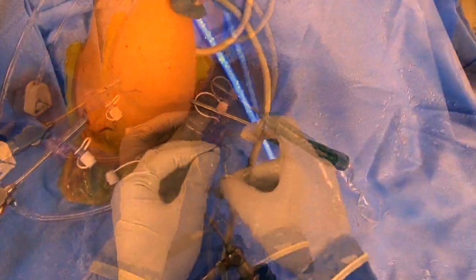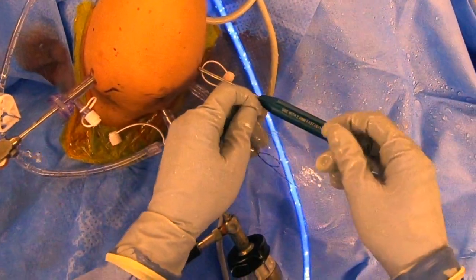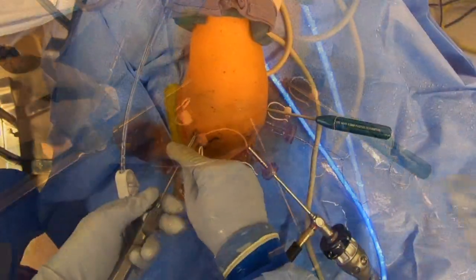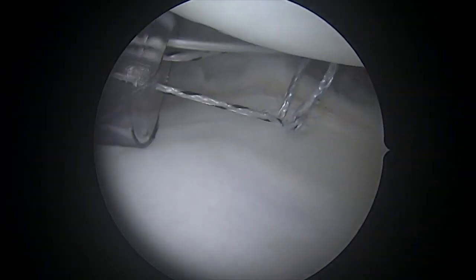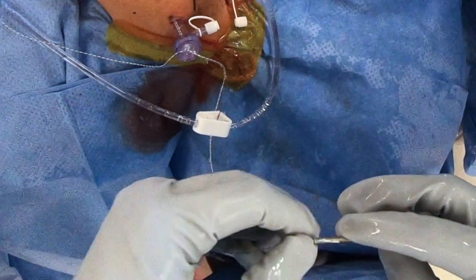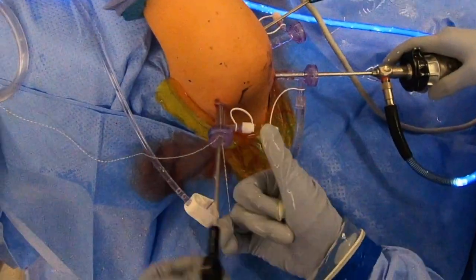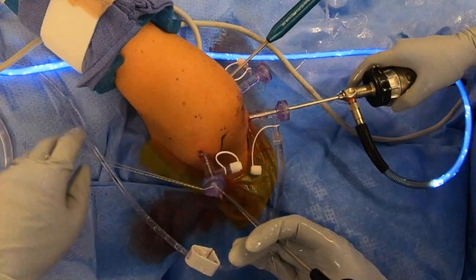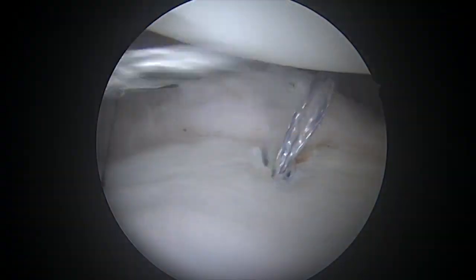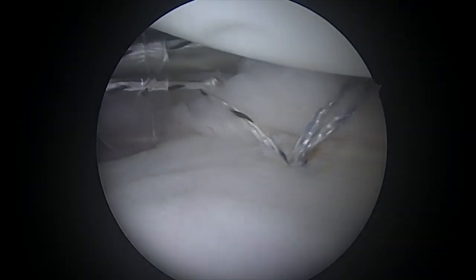We'll create our loop, pass our suture, and then retrograde pass that suture back using the suture puller. Grab the other one from that same posterior portal, and then I usually just tie simples. The benefit of a simple is that it creates a very tight wrap around the labrum and the capsule, and it also creates a nice bumper of tissue.